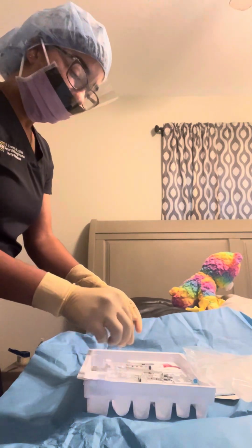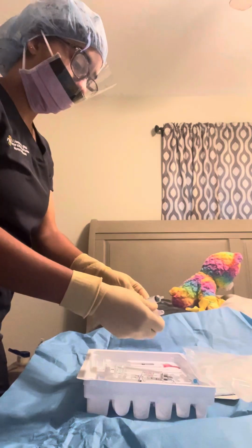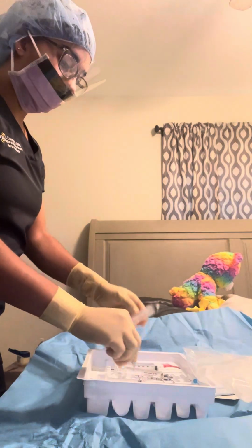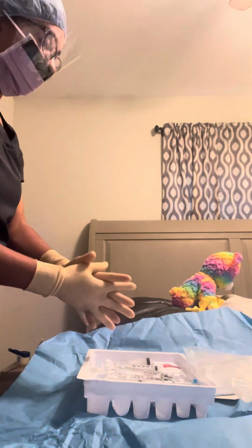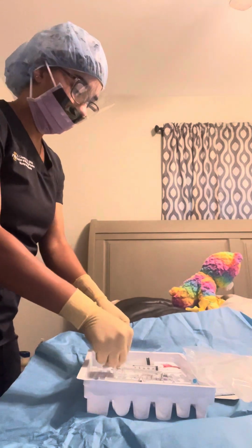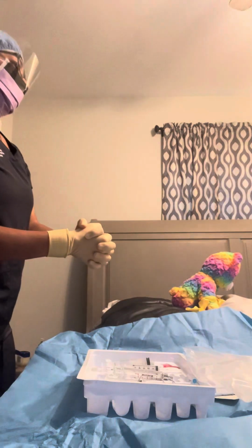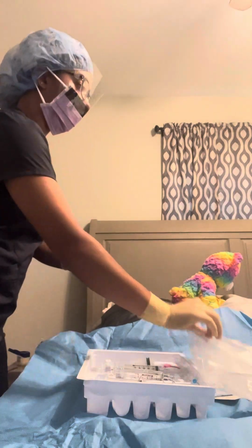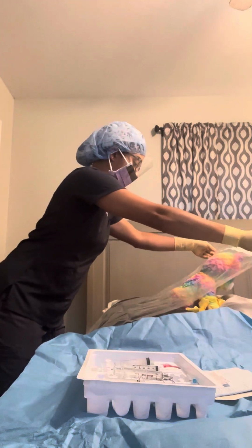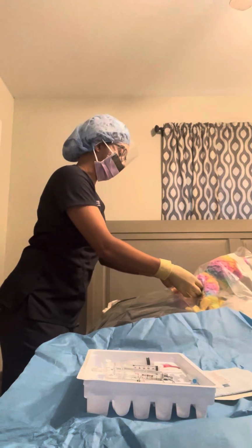And I will draw up in a 5 cc syringe lidocaine with the epinephrine test dose in it. And in my 20 ml syringe, I will draw up bupivacaine 0.25%. And I will use the filter to draw up these medications from the ampules. After that, I will place the drape on the patient. And reconfirm my interspace and the patient's position.